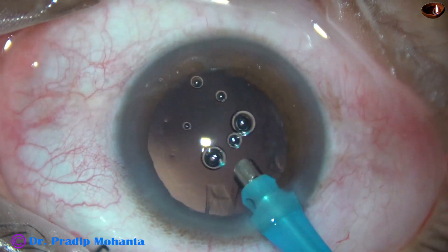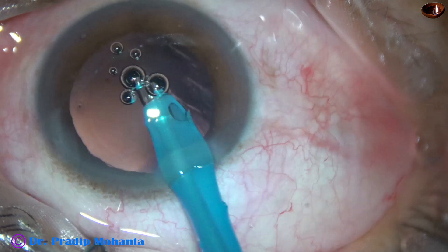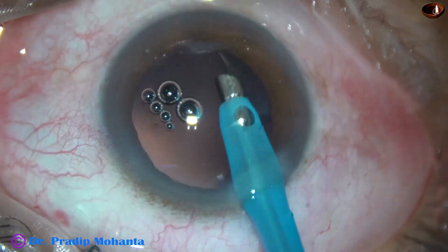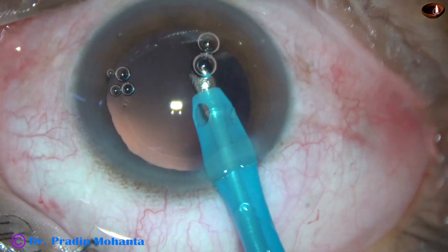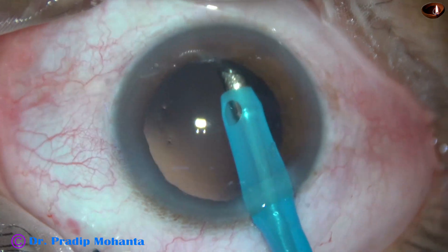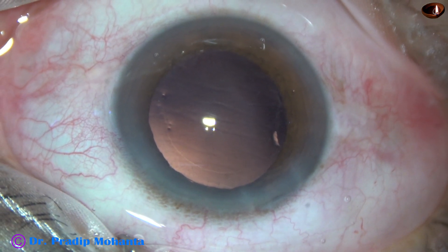Anything is cumbersome at the beginning, but as I do it in some more cases, probably this will be a very quick way of cortical removal and it will be quite safe also. But there are safer ways of cortical removal. I am not recommending any surgeon to do this.